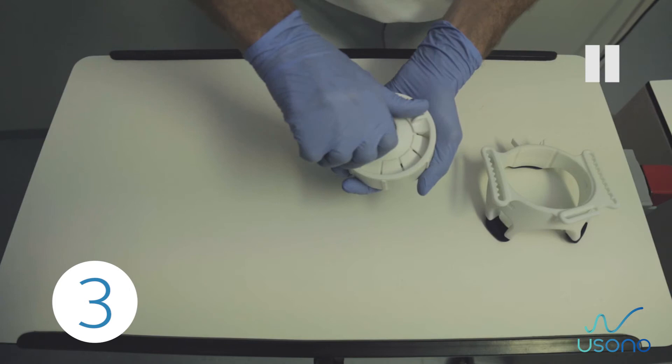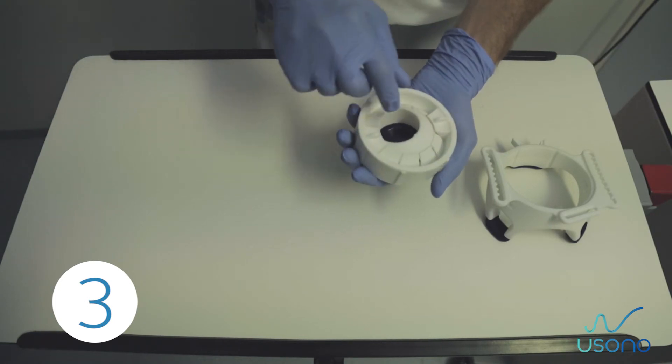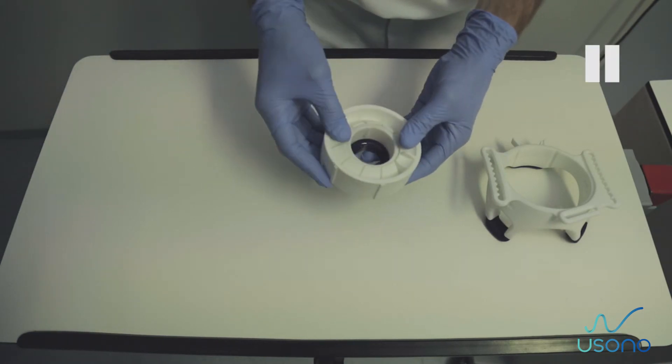Step 3. Holding the bottom part, press and rotate the sphere clockwise until the part is locked in place.